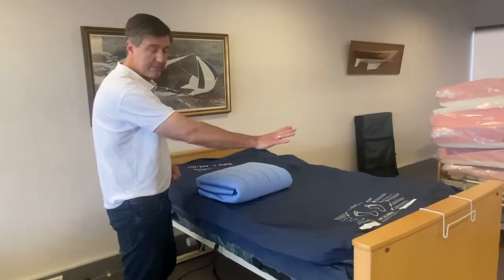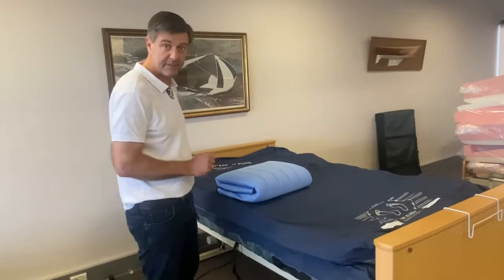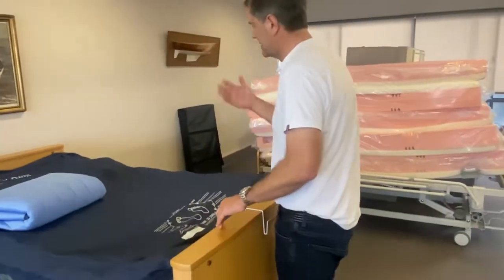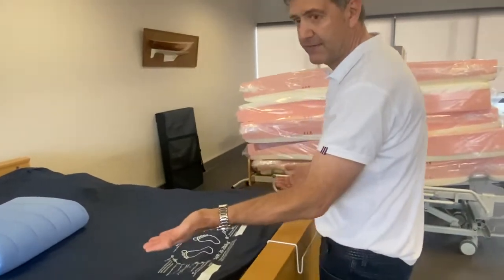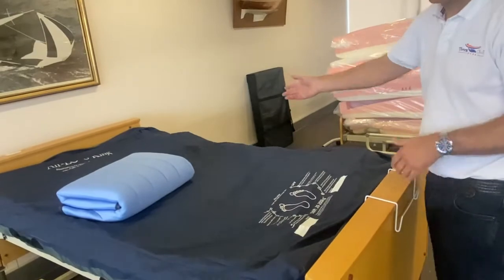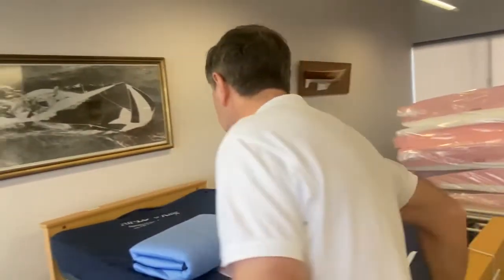Now this is the foot of the mattress, this is the head of the mattress. When I refer to the right side and the left side, I'm referring as my point of reference the foot end. So this is the right side and this is the left side. The hoses and power cables go up the right hand side, so we'll be working on the left hand side of the mattress today to fit the coverlet.